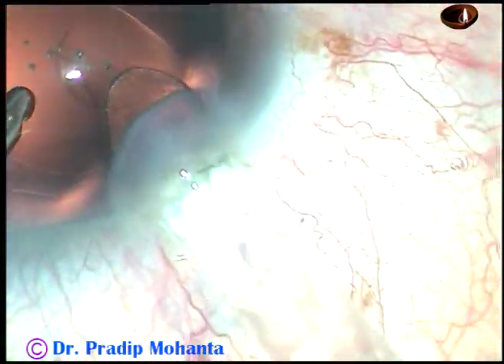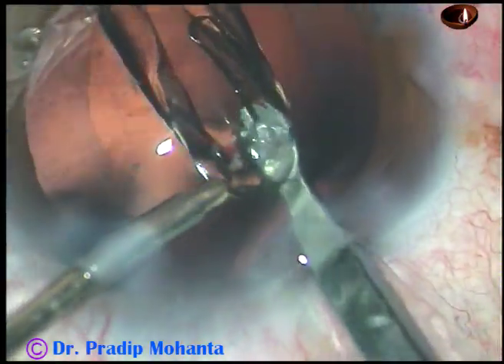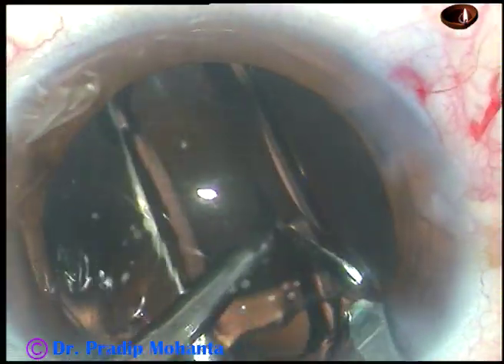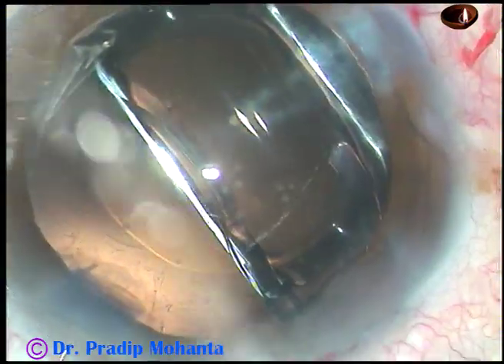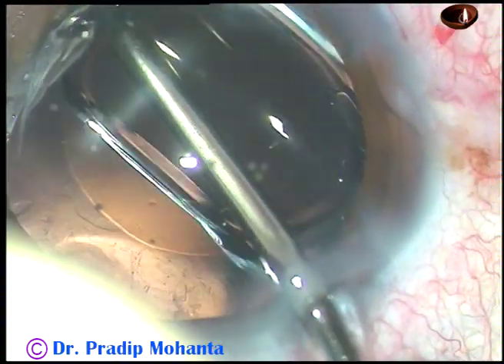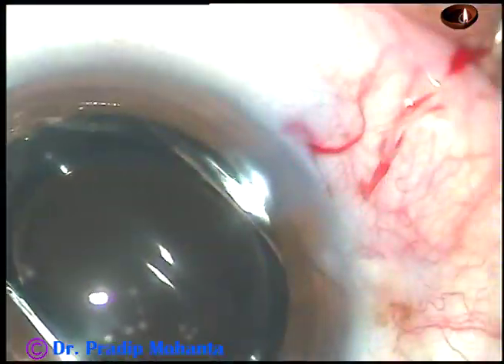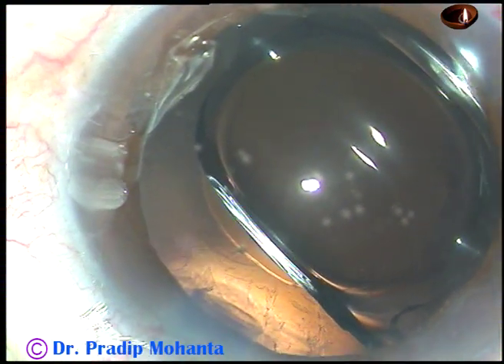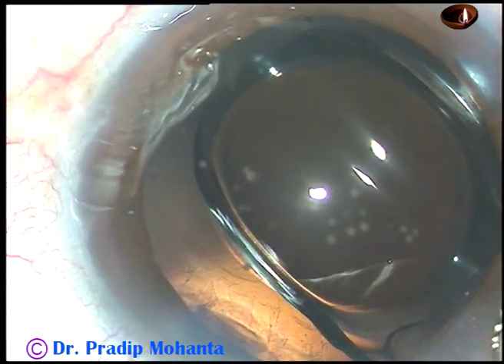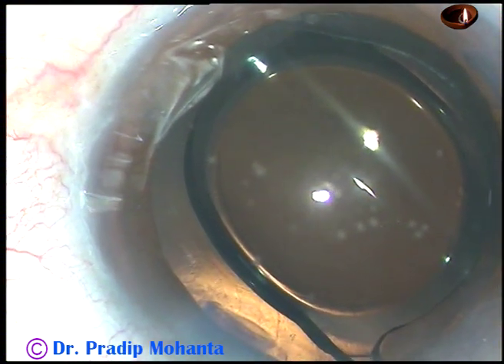Now this is hydro-implantation of the Tecnis single piece intraocular lens. Yes, the lens has gone into the capsular bag. And now a bit of moxifloxacin is instilled.